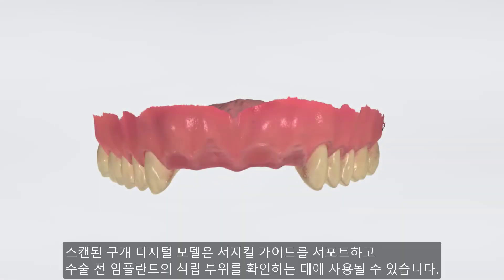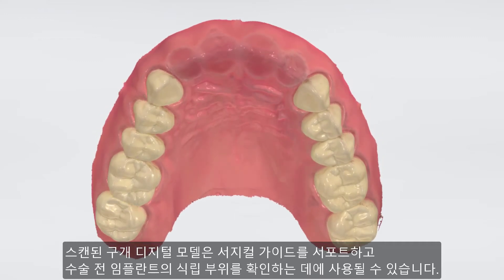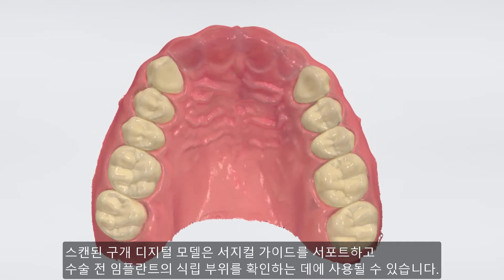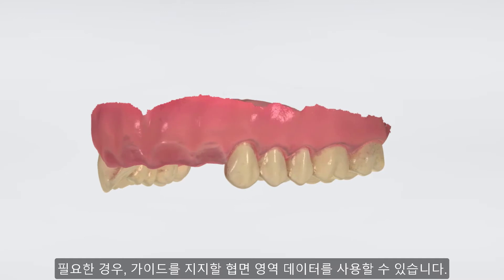Now we can see a digital model with the palate that can be used for supporting the guide and also for letting the surgeon inspect the area prior to surgery. On the buccal side, we have the area to support the guide as well, if needed.